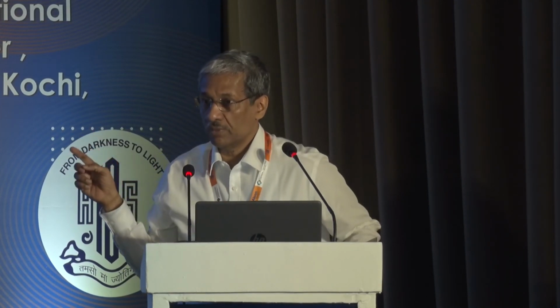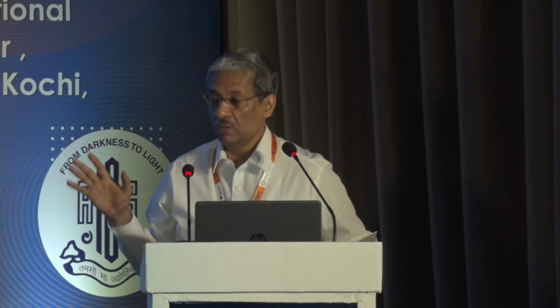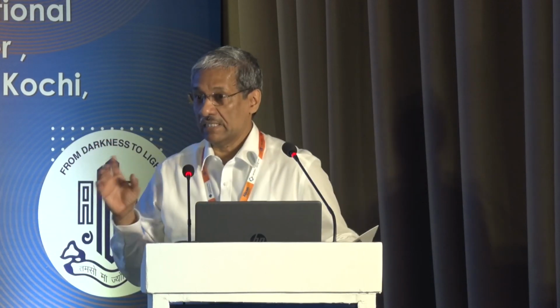You're talking about the central topo? You're talking about the K from the central topo? So the way, yeah, this is a screening tool to tell you: normal, do whatever you like, or abnormal, please evaluate these eyes further. So it is just a screening tool. The data from this is not used for the calculation.